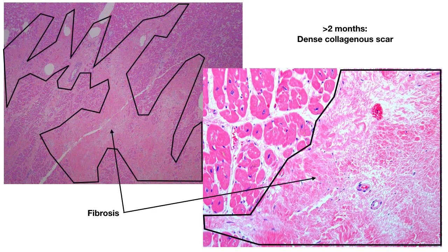What we see here is basically a dense collagenous scar. The left side is lower power and the right side is higher power, closer up. You can see just dense collagen and dense fibrosis — it would stain blue with trichrome, and there is hardly any cellularity to it. This is what you would see at greater than 2 months: a dense collagenous scar.